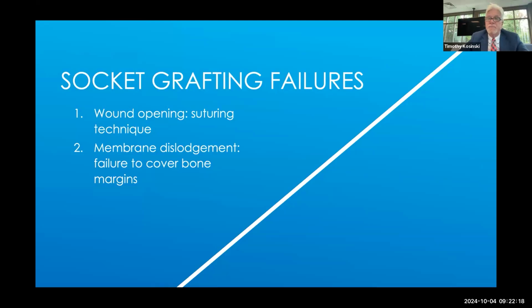That membrane must be placed passively, and it must extend at least 2 millimeters beyond any defect, and it must remain intact for at least 6 weeks. You need to use high quality materials. I use Newport Biologics from Glidewell. I have great successes with it.